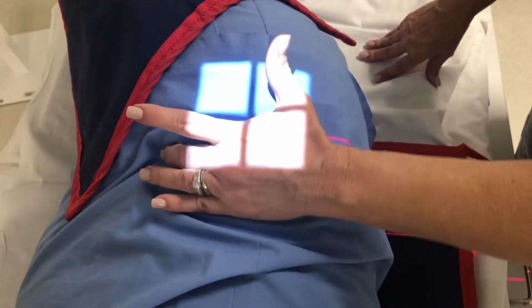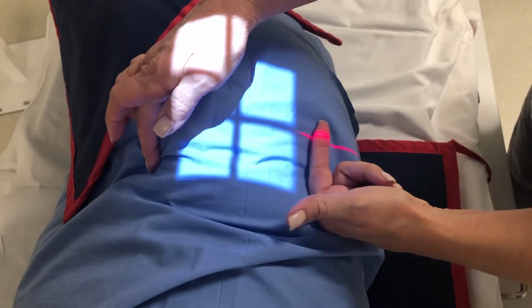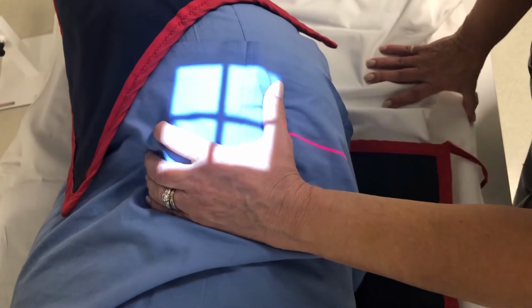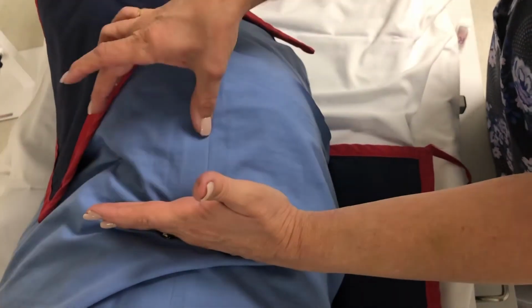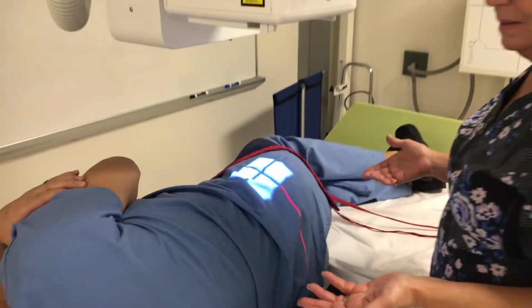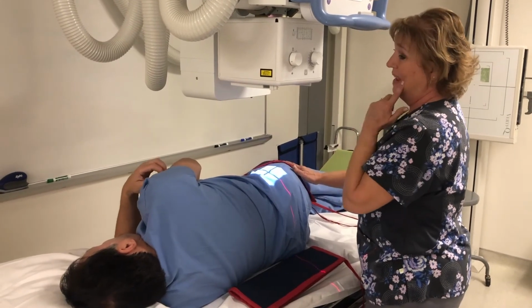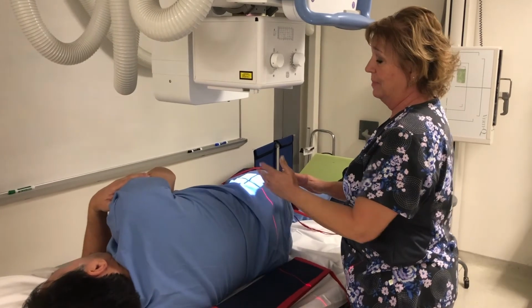So ASIS, my hand on his crest, and actually what that ends up being, for the most part, is approximately, actually, I gotta go a little bit back. It's approximately 3 inches back and about 3 inches down. Now, depending on the size of your patient, that measurement is going to vary a little bit. Your book talks about it 3 and 3 or 4 and 4. I don't exactly remember, but again, the book is a guideline and you have to position based on your patient's body habitus.